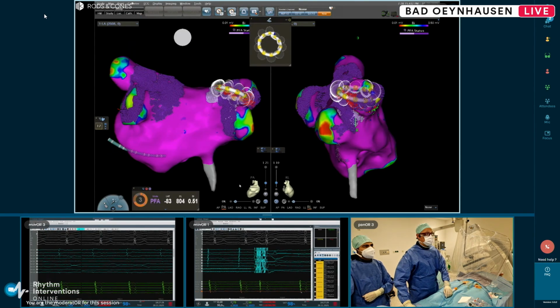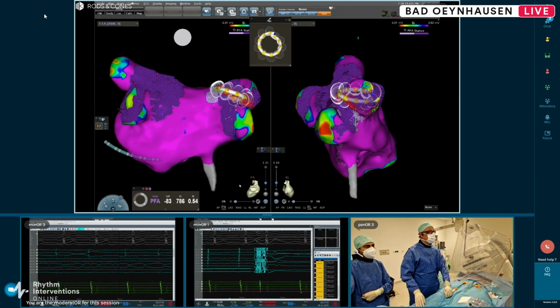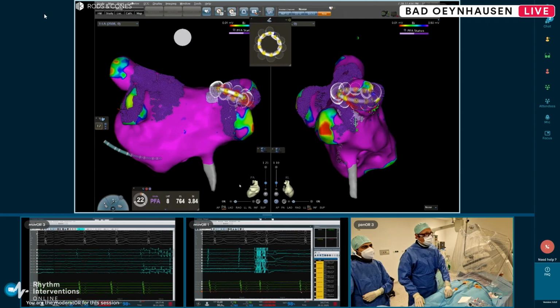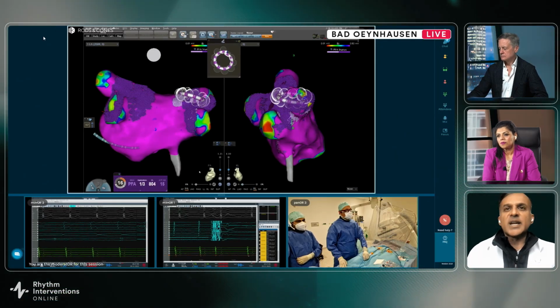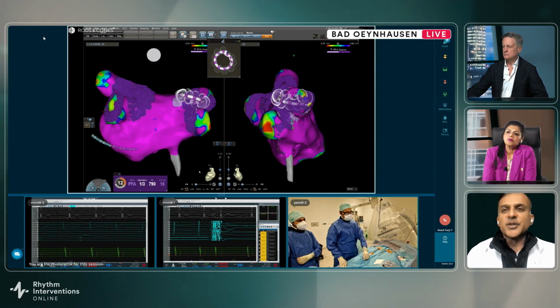Yes, we started using the 30 cc flow rate really from very early on. There was some data that Will Sauer published around HRS about the joule heating potential; it generates 1800 volts over 250 milliseconds.